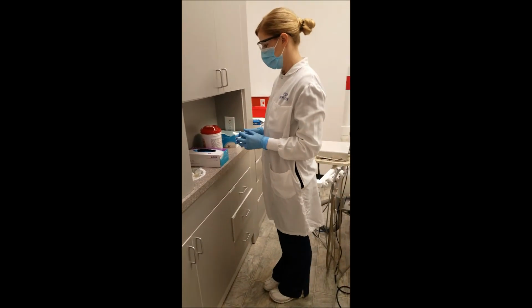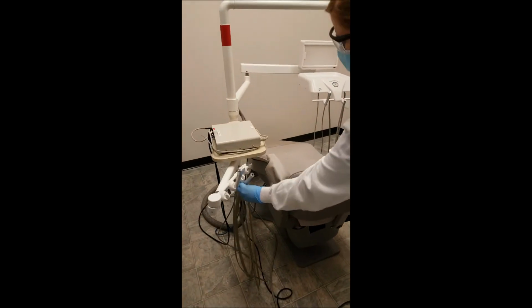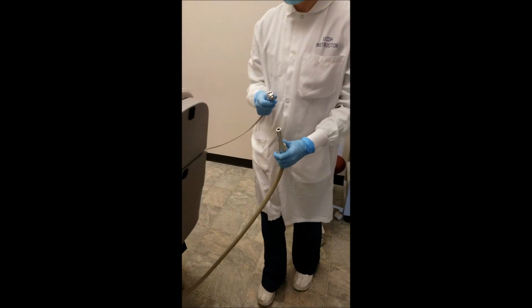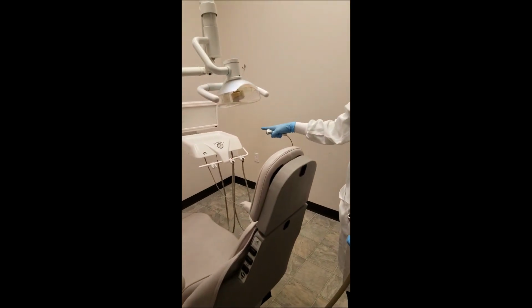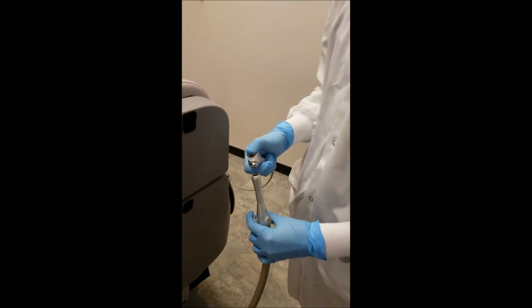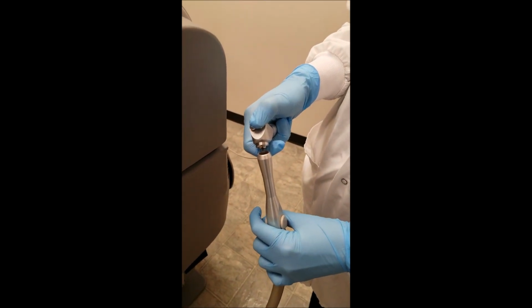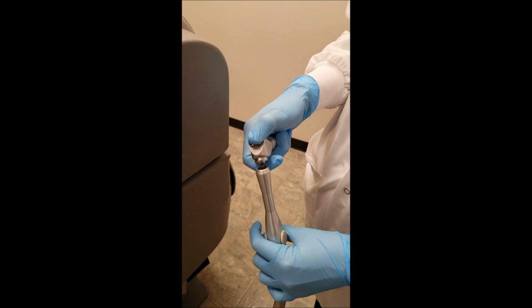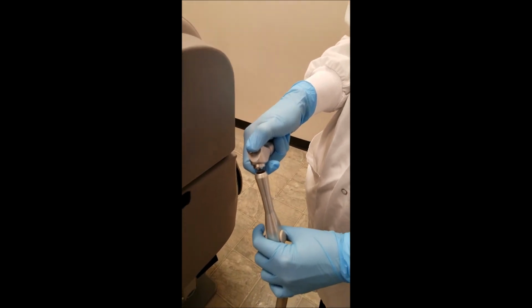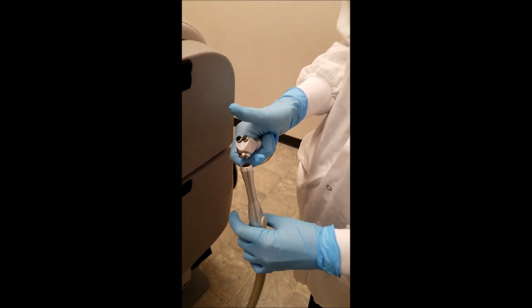And then she will flush the air water syringe line for 2 minutes at the start of clinic and 20 to 30 seconds in between patients. So another helpful hint, we always use the air water syringe that's on the bracket tray over here, not this one on the accessory arm. And she will hold it as close as she can to the suction without actually touching the suction. With my air water syringe. So you are supposed to do that for 2 minutes and then 20 to 30 seconds between patients. For this video, that will suffice.